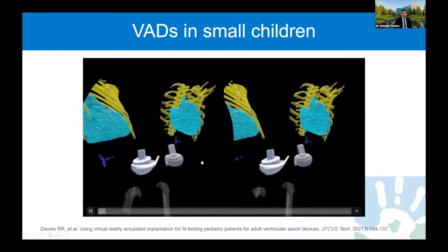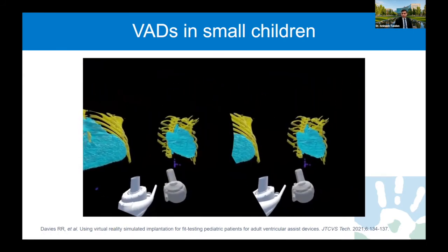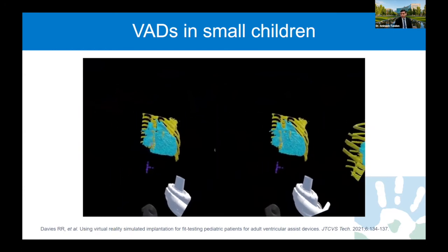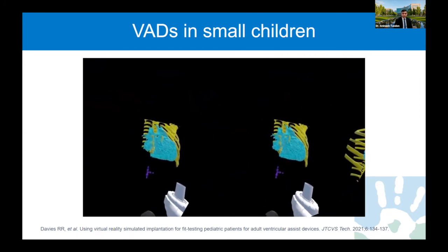And so this kind of technology has allowed us, in Dallas, to place the HeartMate 3 in 2 of the smallest patients described in the literature to date, both with body surface area less than 0.8.